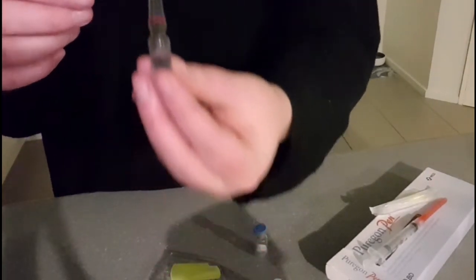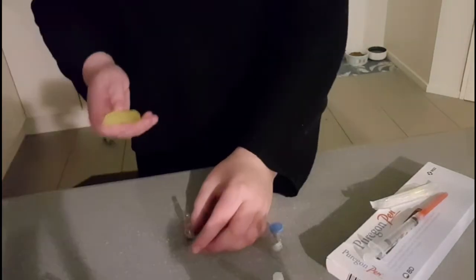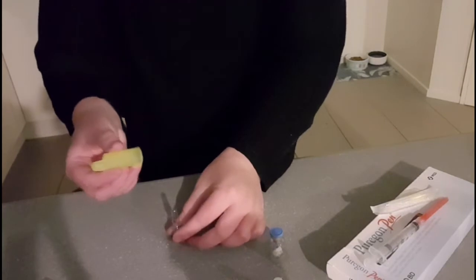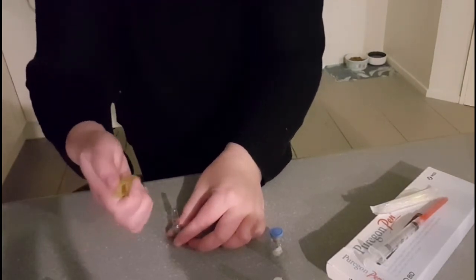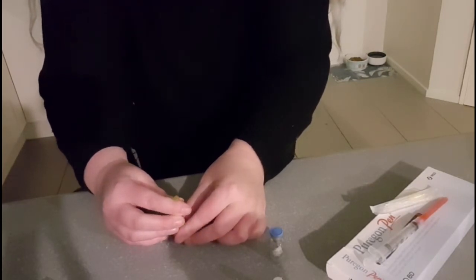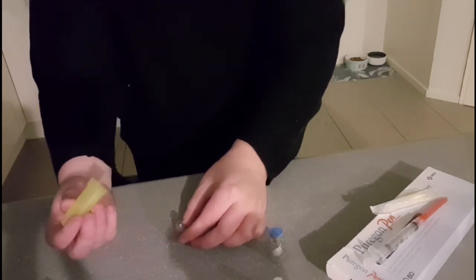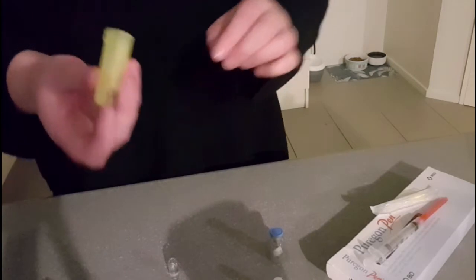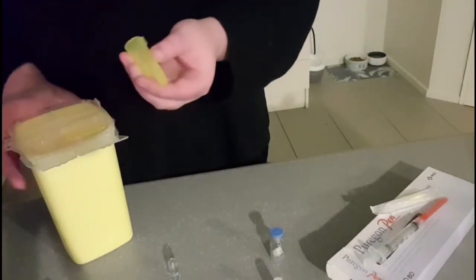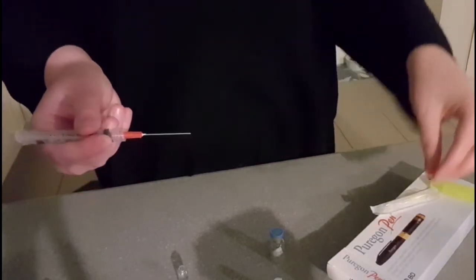There's also an app actually that I downloaded but I feel it's easier to have written instructions. No liquid now — blue dot, hard surface, align that — and it's done. Okay, you just give that a flick into the sharps bin. Don't put that in the sharps bin — you'll reuse this. So we've got our liquid, that is off.